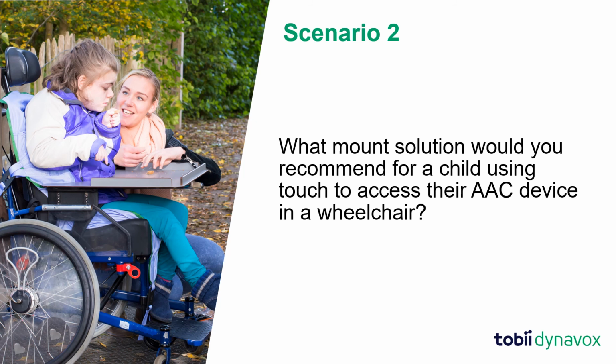with them. Another question might be, do we have a picture of this child in the wheelchair with their AAC device in the optimal position? Remember that a picture of the device at optimal position is a great resource in determining what components might work best.